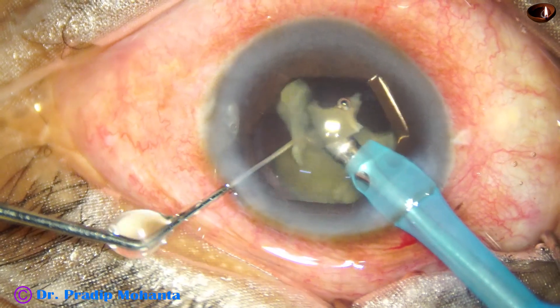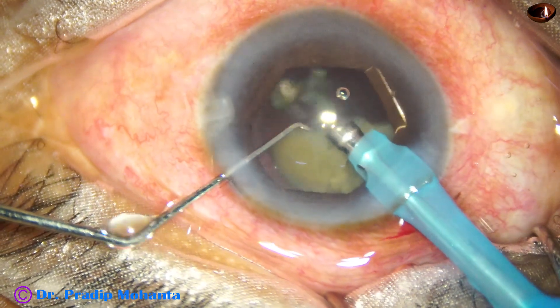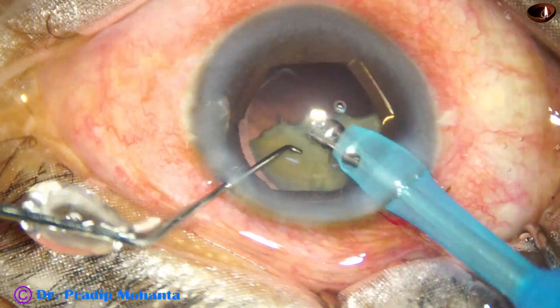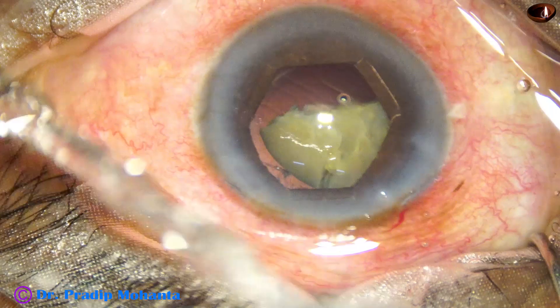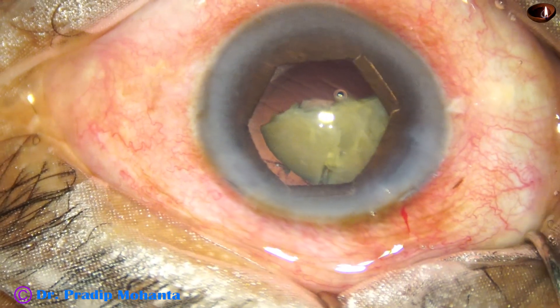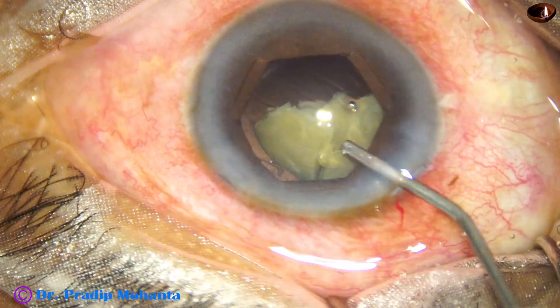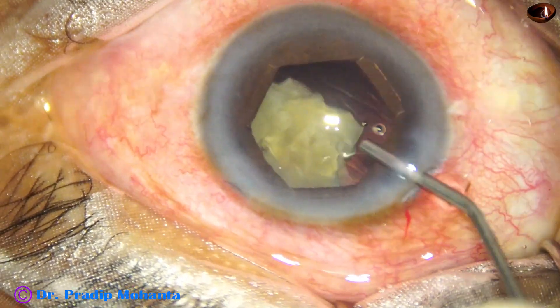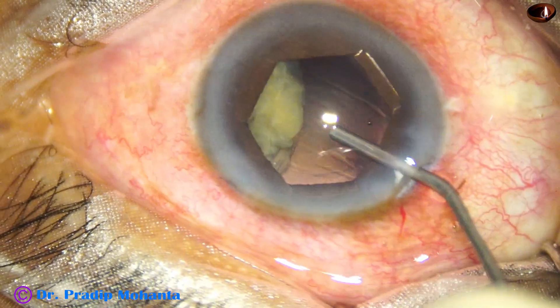I am not going to make a rent in this case. In hypermature morgagnian cataract you need to take special precautions to not cause a posterior capsular rent. And this is the best way — the IOL scaffold technique.